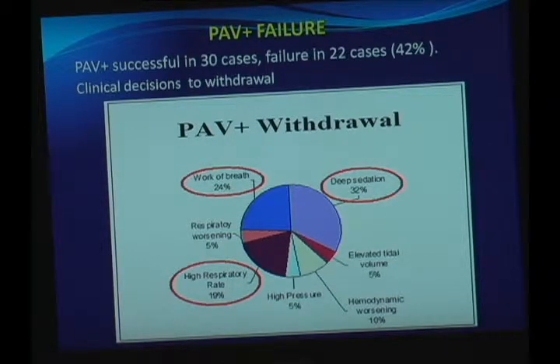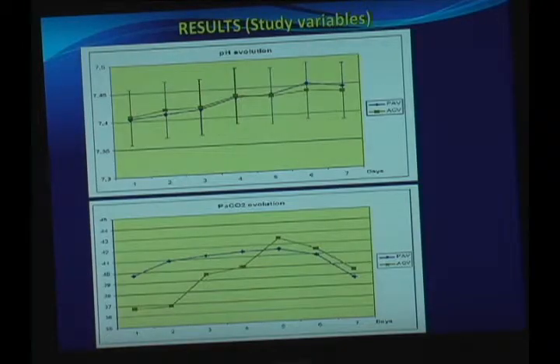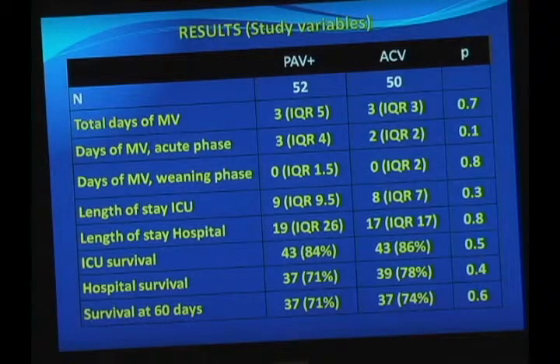And then one of our conclusions. If you go back to the previous slide, so it seems to me that if the patients you enrolled, on average, were spending 2 to 3 days on the ventilator, it's tough for any new, different ventilator mode to do better than that. Sure.